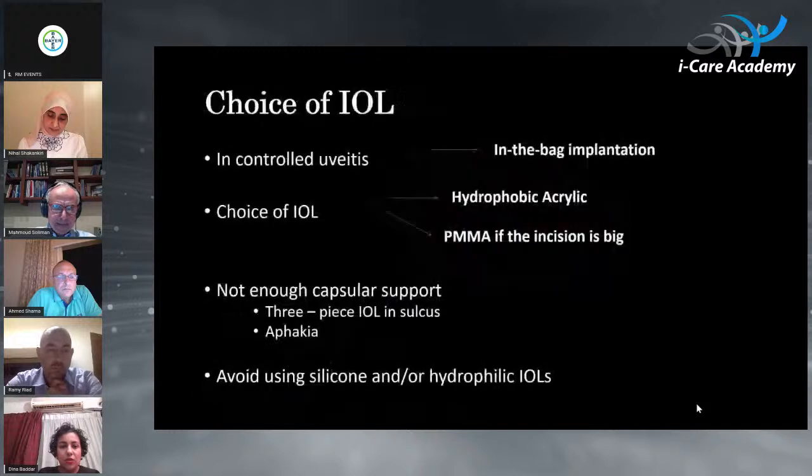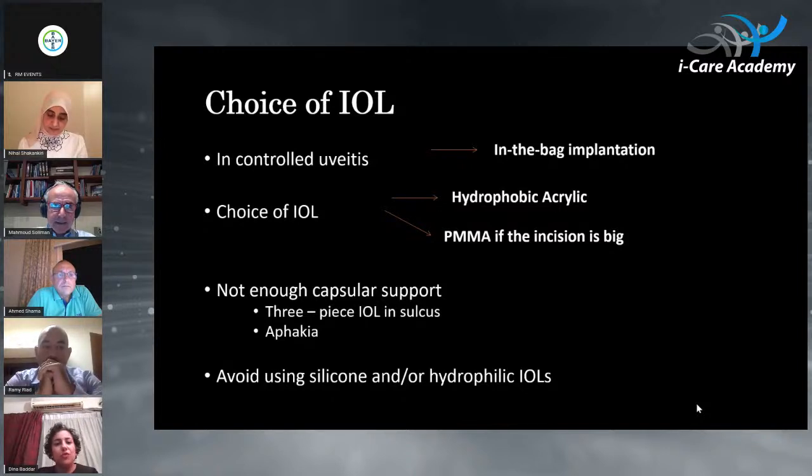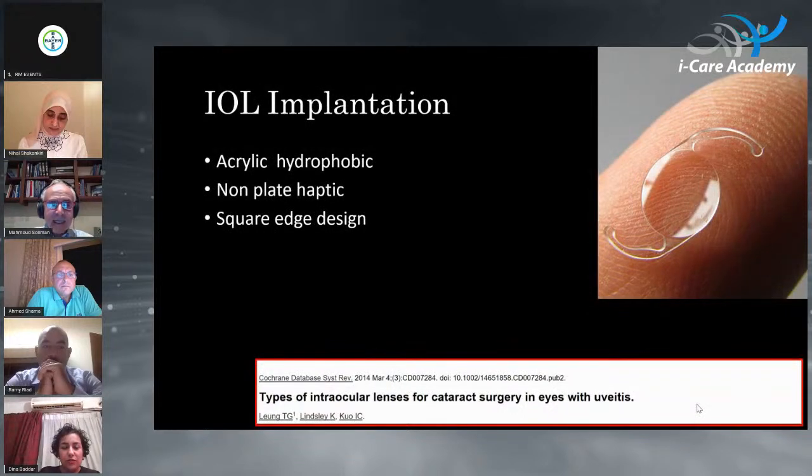All right. So I'm going to leave the choice of IOL. Any comments on the choice of IOL? Okay. So, IOL implantation in the bag.